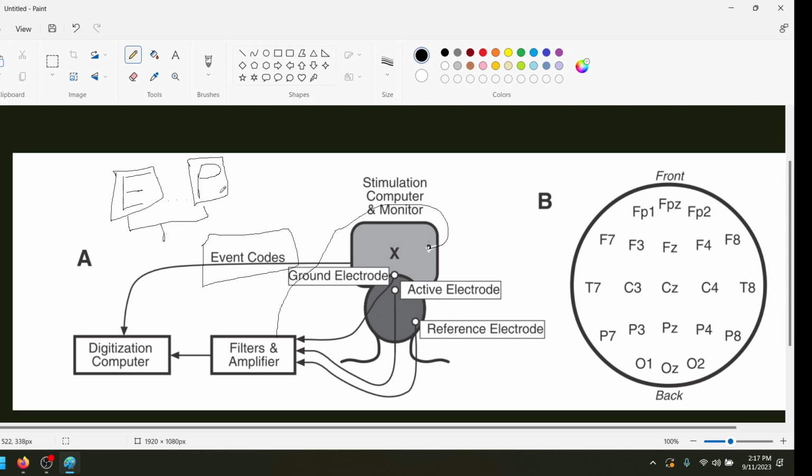So what you need to do is find this delay and correct for it. If you want to epoch, which is the verb that we use, if you want to epoch or synchronize the data to when somebody saw an event, you need to determine what the actual delay was from when the event code was sent to when the monitor drew it on the screen. And this delay is limited by the sampling rate of the monitor and just general monitor technology, your video card, operating system scheduling, all of that jazz. And the easy way to correct for it is to just use a photosensor.